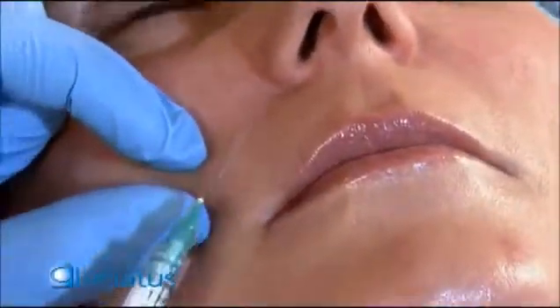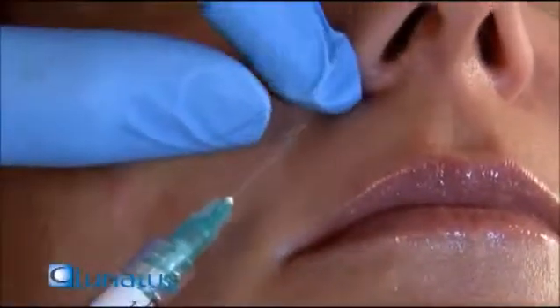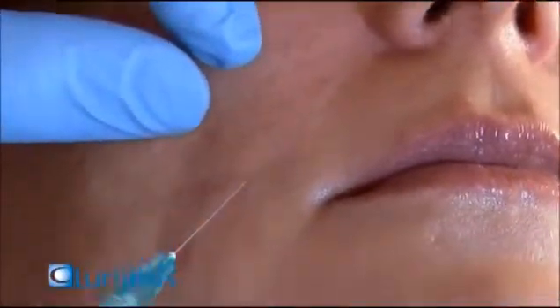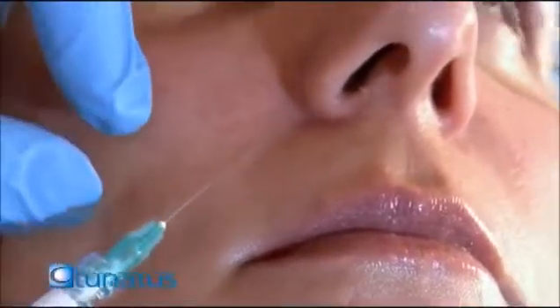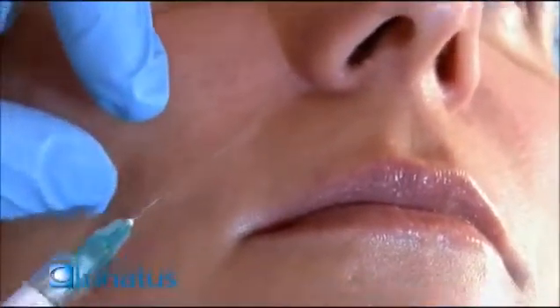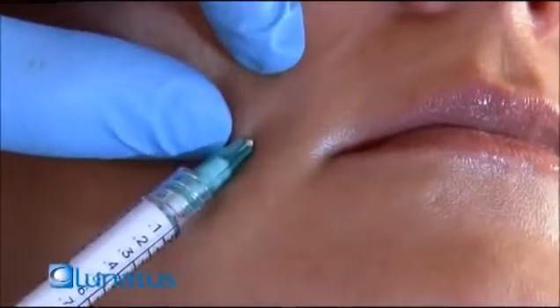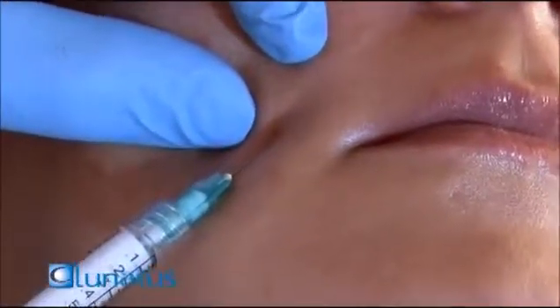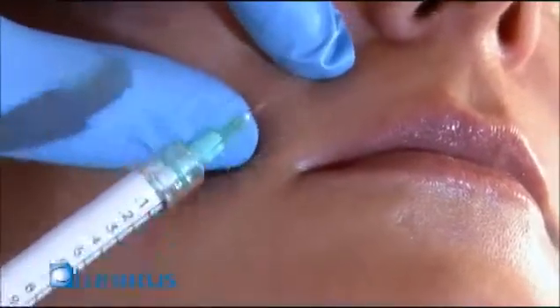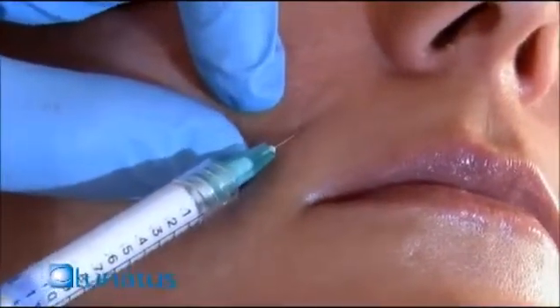We're going to do the nasolabial folds now first. One approach is to start from the nose itself, right where the crease is — the soft triangle over here. Or you can inject from the lower going up. Personally I go both ways, but if you have filler material with lidocaine you want to start from the bottom. Once you inject — this is the retrograde injection, I'm injecting as I'm coming out — then you stop. Moving up a little bit, this area has become anesthetized by the lidocaine, so the next injection should be slightly less painful.